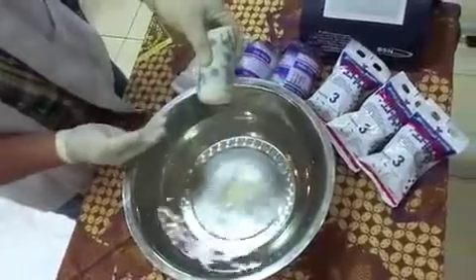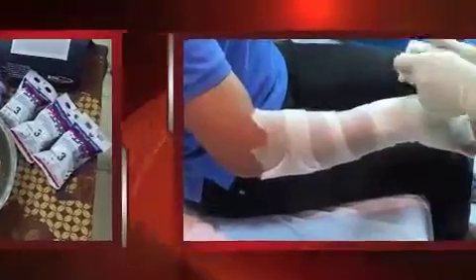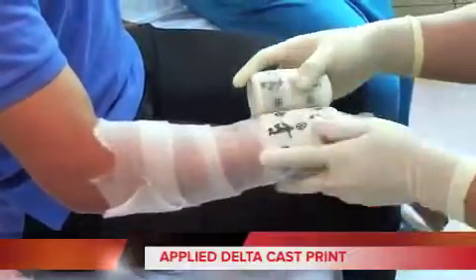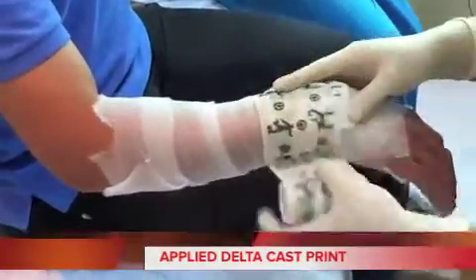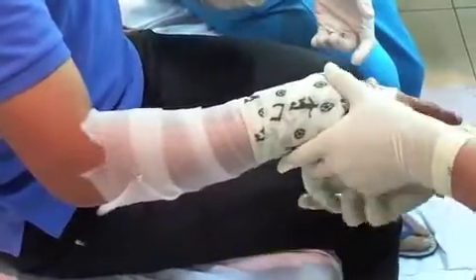As you can see, it is very clear, no mess — not like POP classic plaster. Now, we will apply the Delta Cast Print. We put 4-5 layers on the fracture side, then go to distal to make 2-3 layers of cast.